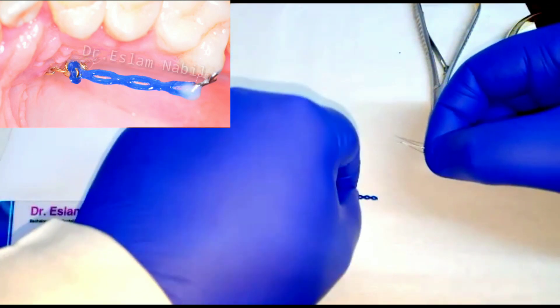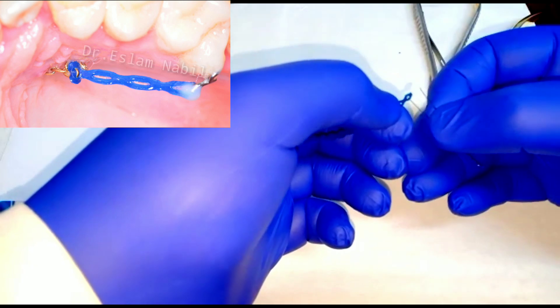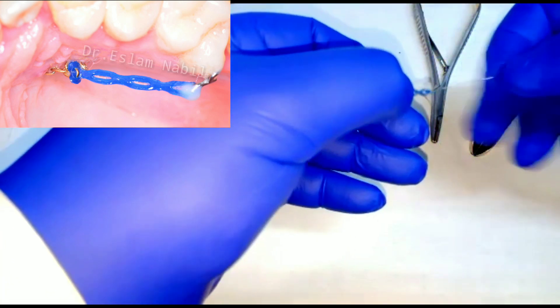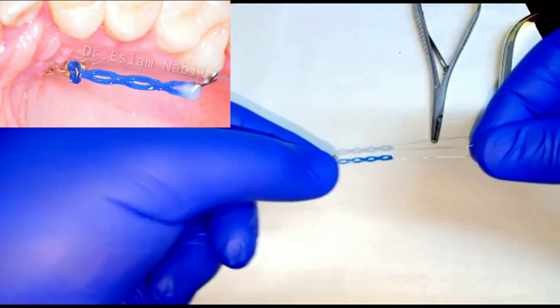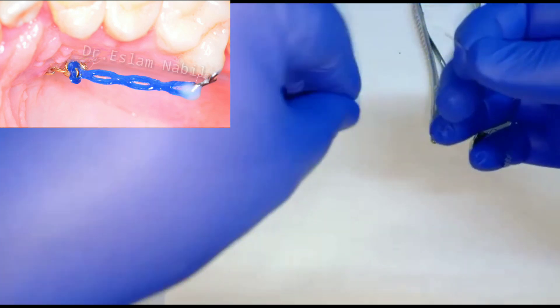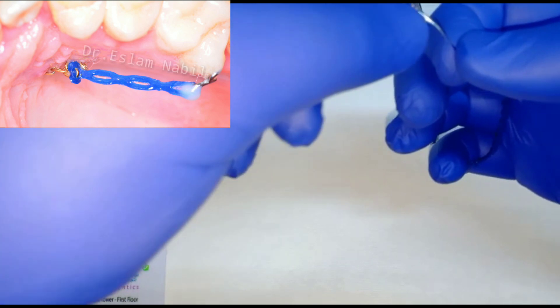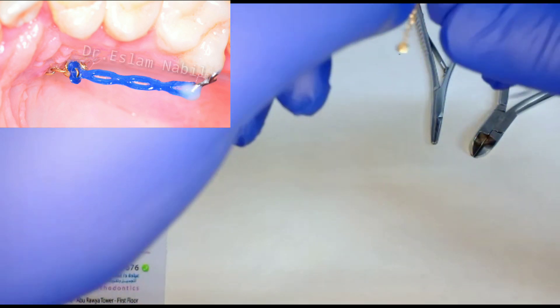We will pass the first end of the ligature wire through the first ring of the power chain. Then passing the two ends of the ligature through the first ring of the gold chain.